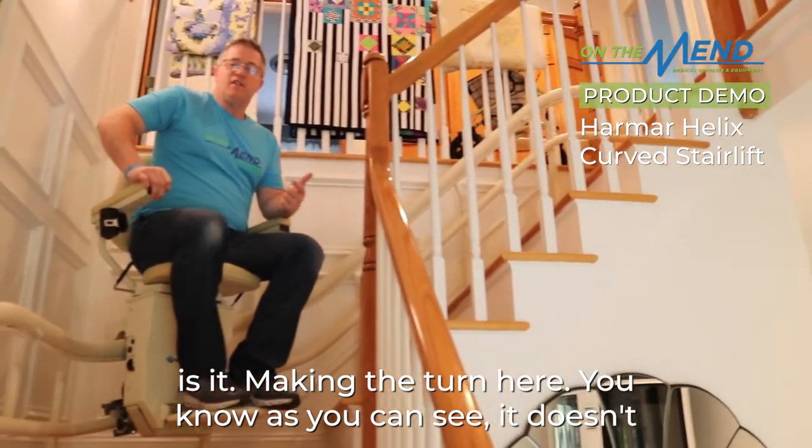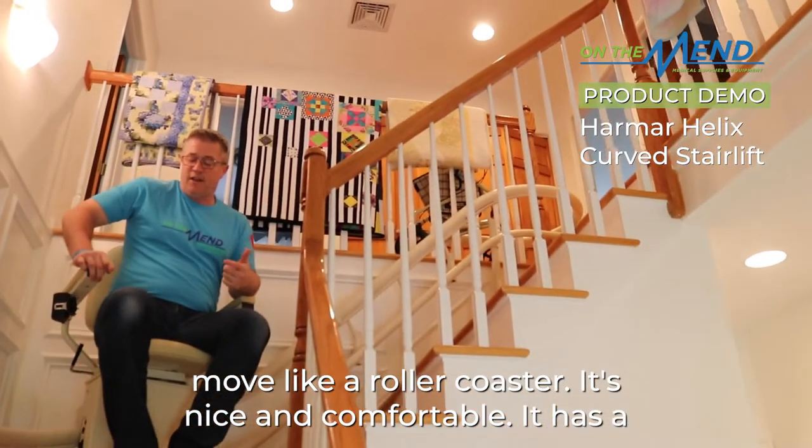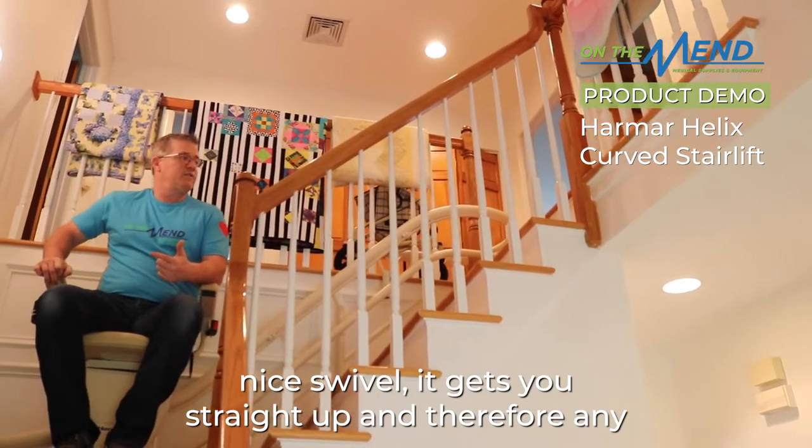Making the turn here — as you can see, it doesn't move like a roller coaster at all. It's nice and comfortable, it has a nice swivel, and it gets you straight up.